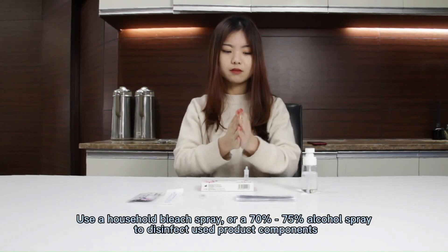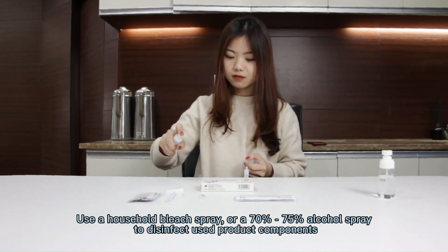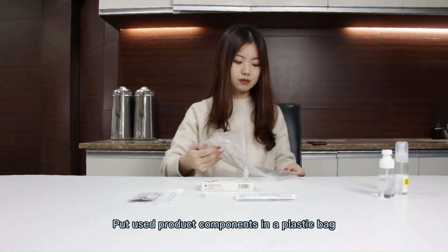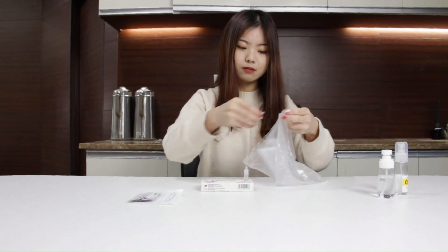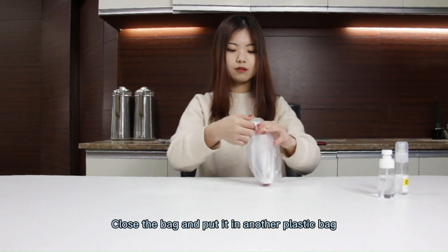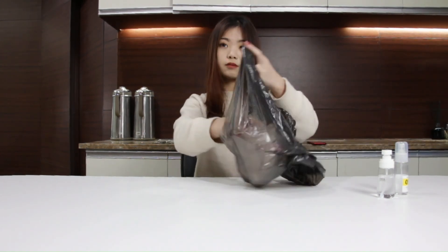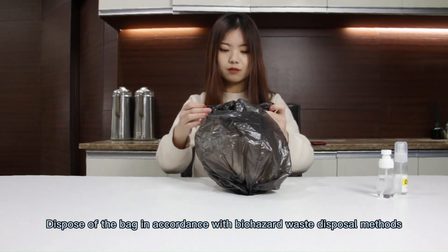Disinfect the swab and used product components. Put used product components in a plastic bag. Close the bag and put it in another plastic bag. Dispose of the bag.